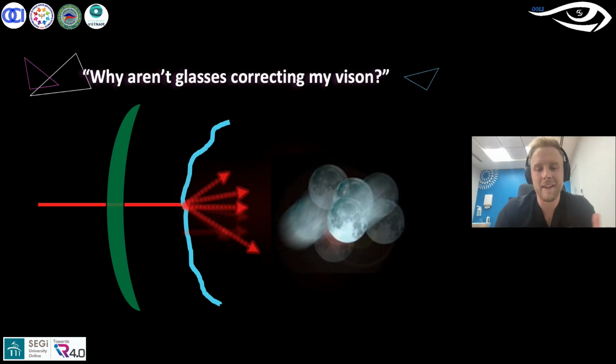And we ended up fitting her with contact lenses, but this kind of stuck with me, about having that goal that was the one thing she wanted to do. And that was what I would set the bar at. That's what I want to make sure that she can see to really start living her life again as it was pre-keratoconus. But yeah, this simple diagram here that I have on screen will really clarify and highlight to the patient some of the difficulties that they have.